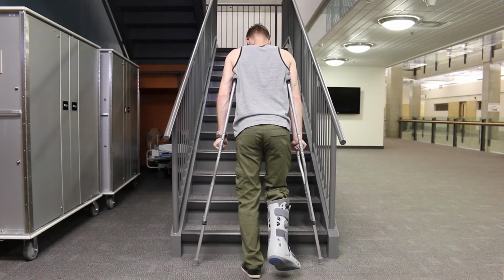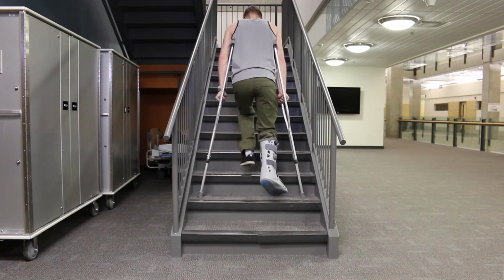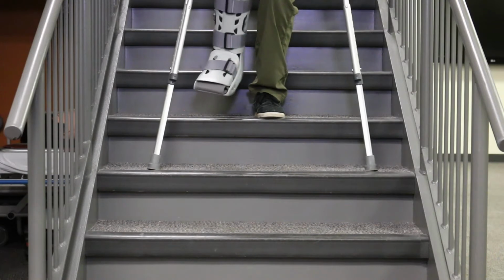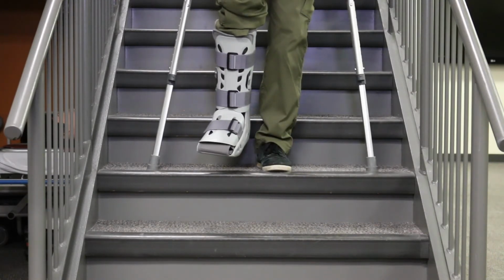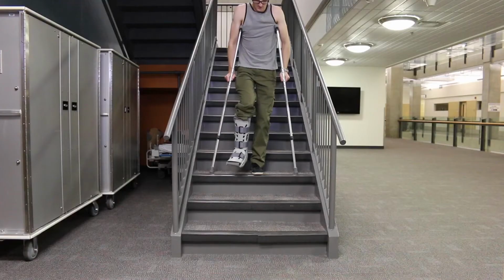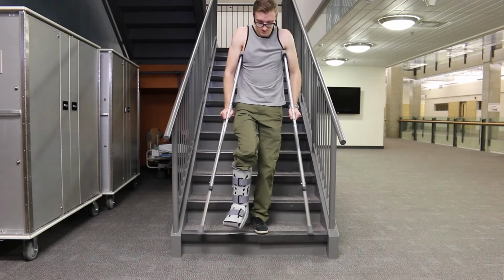When using stairs, a saying to remember the proper sequence is up with the good, down with the bad. Hop up the step with the good leg, then bring up the crutches. Repeat as necessary. When descending stairs, place the crutches on the lower step, followed by the injured leg, then hop down with the good leg. Repeat as necessary. This method of going up and down stairs is the most dangerous and requires a high degree of coordination.